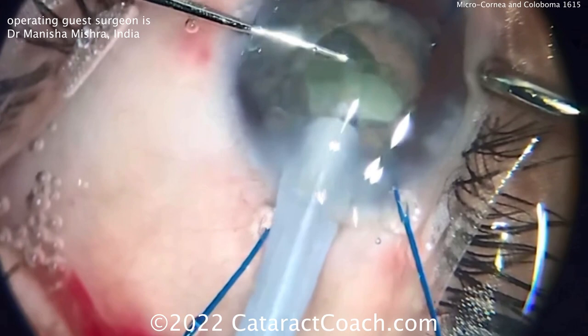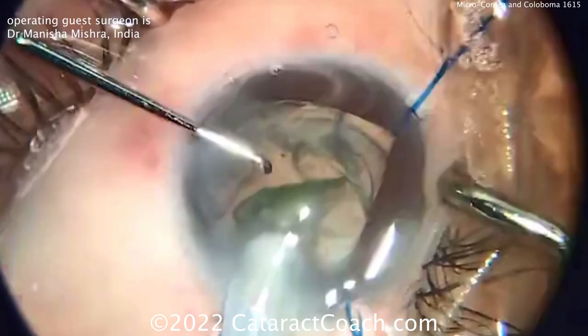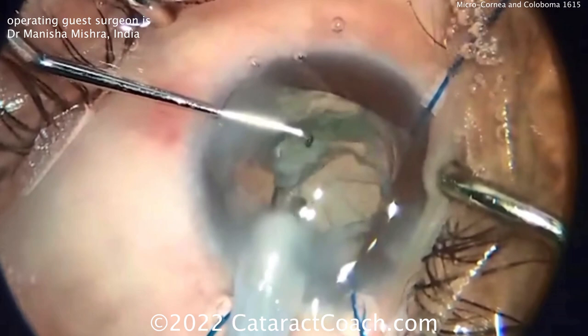Phaco being done here, getting that nucleus out. The key here too is making sure you have good stability of the new IOL when it's placed in there, and also making sure you've got no vitreous prolapse from around that one area of the coloboma.